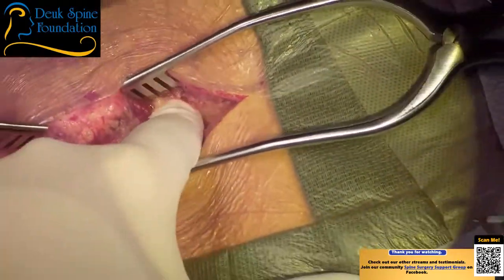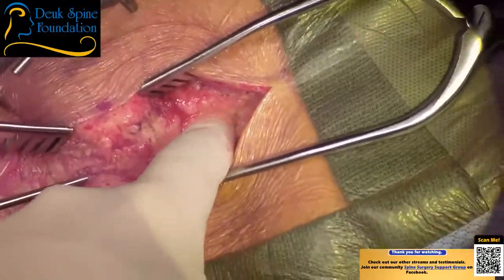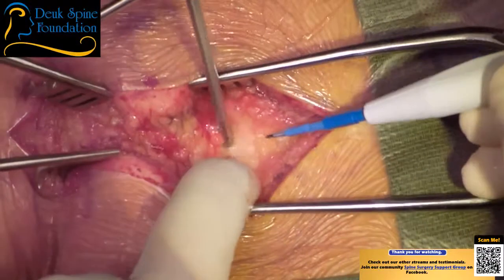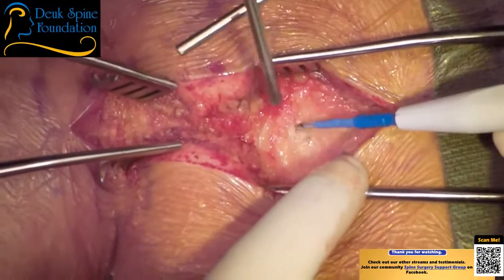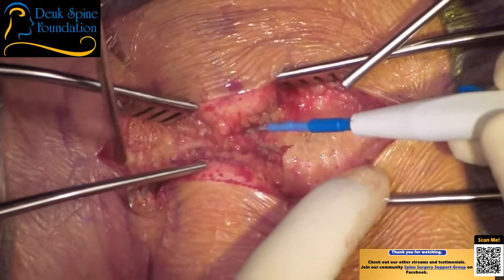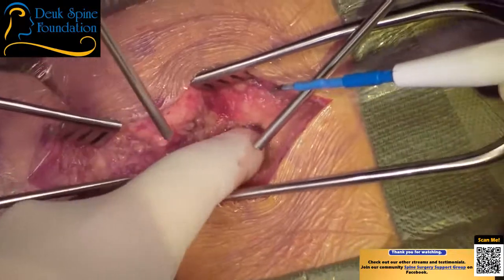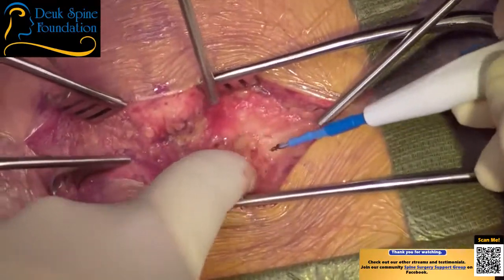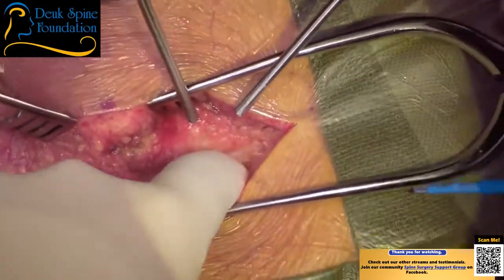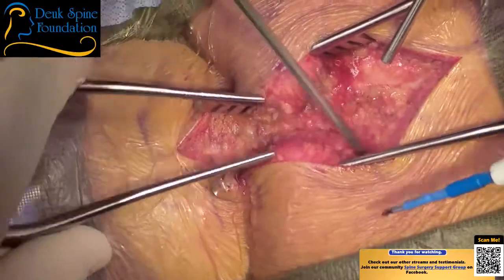So as a resident, when I was learning how to do this, I was told to palpate for the spinous process. And so that's what I'm doing, okay? All right, so you make your best guess with the skin incision and then you palpate. Our patient's body habitus is one of a lot of soft tissue. So I have to figure out how to get down to the spine through all the soft tissue. Patients who are heavier also require bigger incisions, usually.